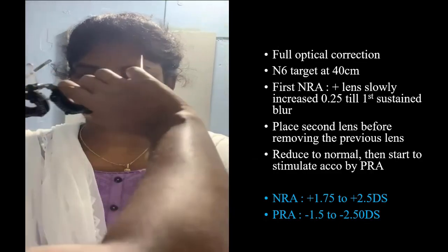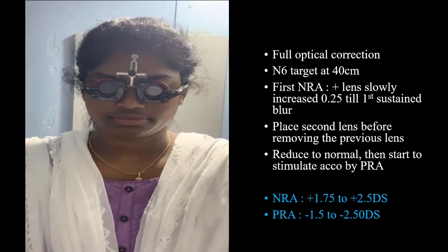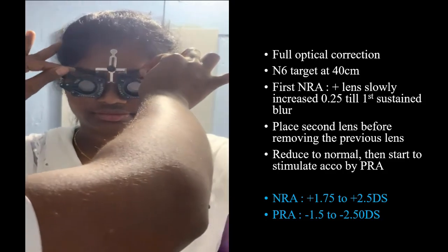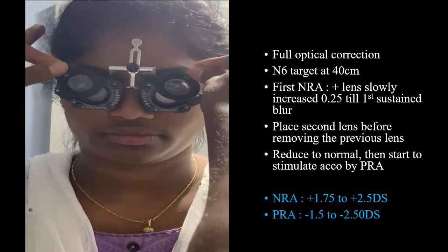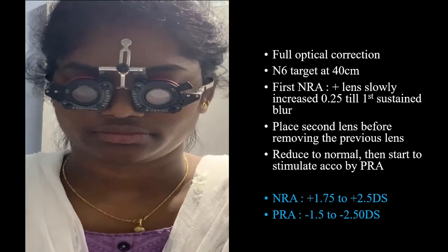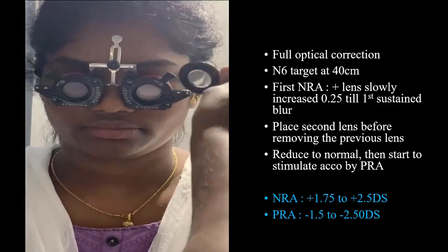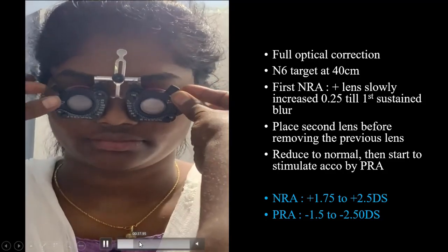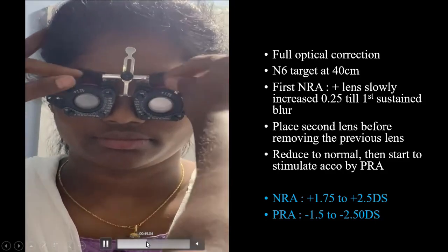First we'll be doing the NRA. The trial frame with the patient's existing correction is kept, and the patient has to focus at the N6 target at 40 centimeters. Plus lens will be slowly added in increments of 0.25 till there is a first sustained blur. The second lens should be placed before we remove the first lens. Here for this patient, we are achieving it at 2.5.